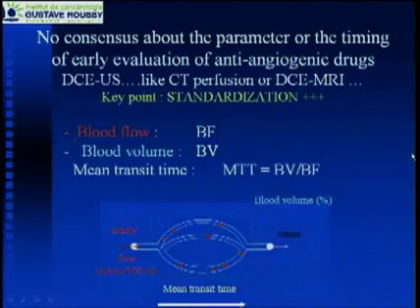But we had to solve some problems with functional imaging, and currently we don't have a consensus about the parameters and about the timing for the evaluation of these new drugs. This is the same problem with CT perfusion, DCE-MRI, and DCE-US. And the key point is standardization.